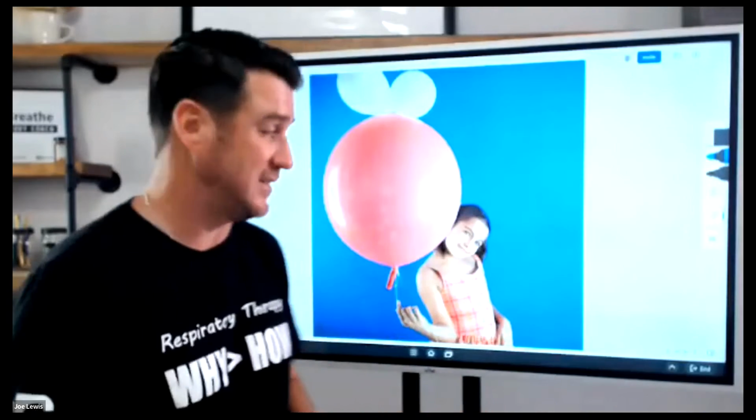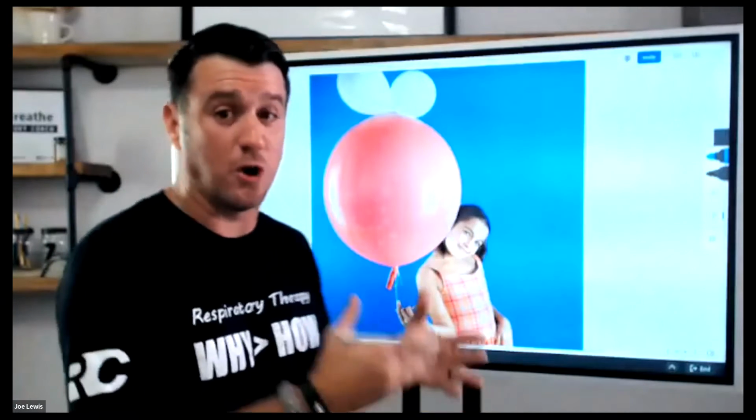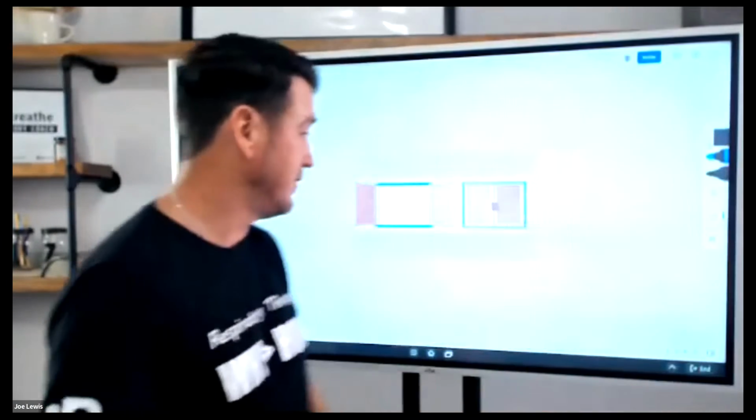We recognize we get in this box where I always use the same numbers, right? 6, 6, 6. If it's PEEP, it's 5, 8, 10, 12. That's all it is, right? We've got to think about how to personalize this to our patients. When they're in spontaneous modes, are we giving them too much pressure support? Go back to COVID, when you had all these patients on BiPAP just chugging away with these ginormous tidal volumes. What was happening? Outcomes weren't good. Good chance that it was related to volume trauma. It's dangerous, it's there. So keep that in mind: appropriate tidal volume size for each of your patients.